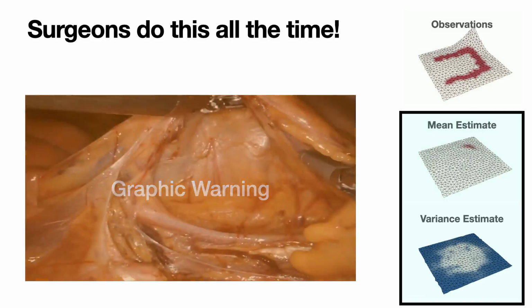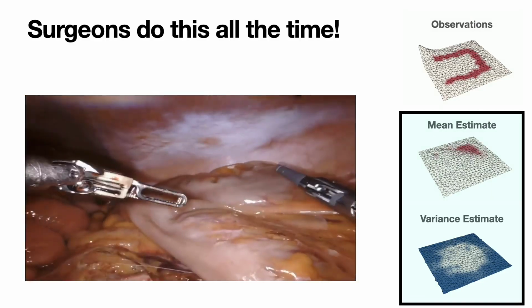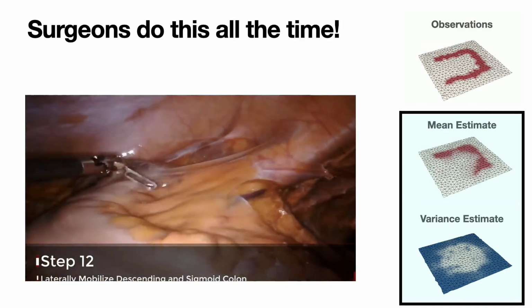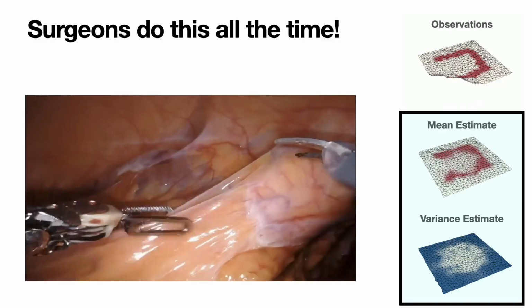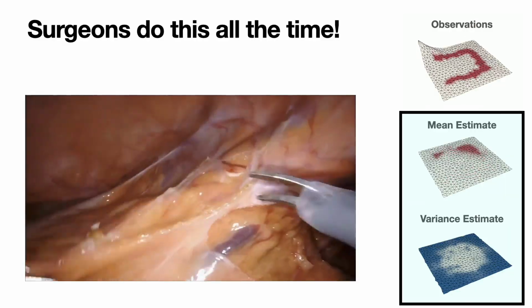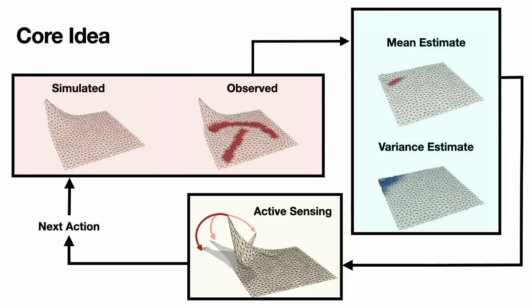These are the questions surgeons think about all the time. They constantly manipulate tissues in the environment to understand the structure and attachments. This is as a large part of operations are spent either removing or creating these attachments. Inspired by this, we present JIGGLE.